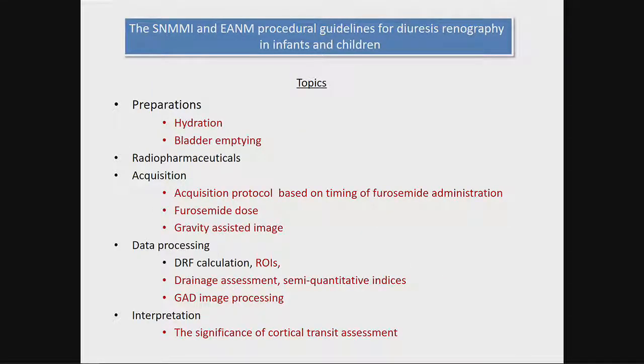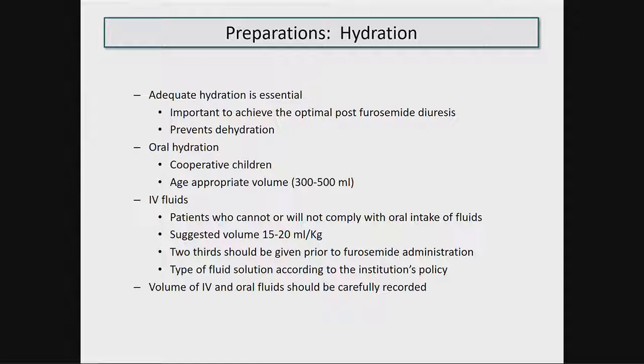Here are the topics I'll be discussing, and in red you'll see some aspects where the new guideline had new information or corrected previous information. So starting off with preparations, and perhaps the most important part is obtaining adequate hydration, because it is essential for optimal post-furosemide diuresis, and it also prevents dehydration.